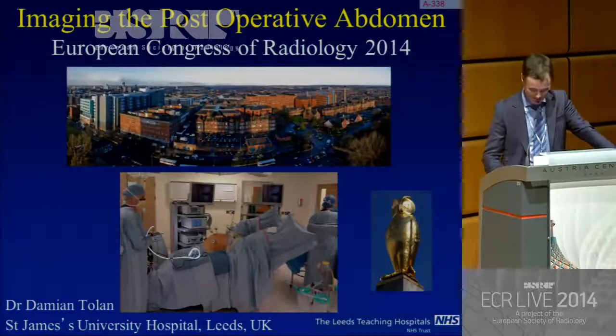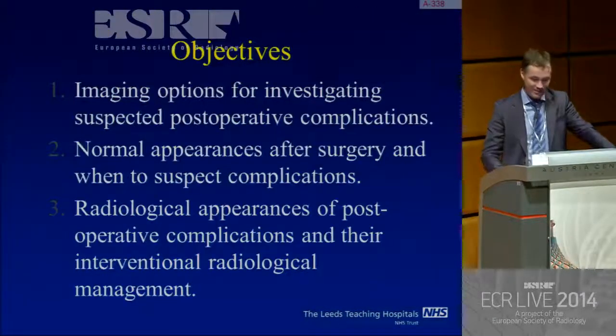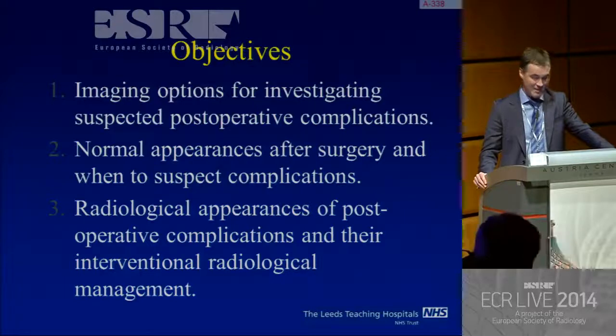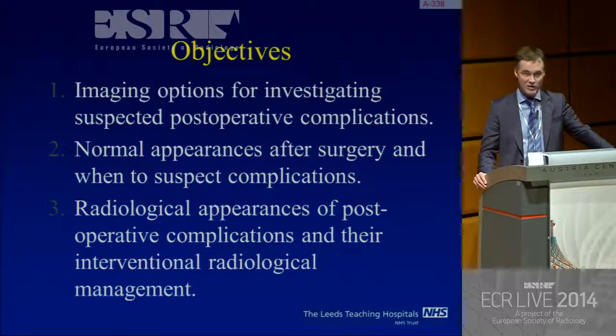So it's a great chance to speak to you all about something I think is really challenging to all of us. We're going to talk about the following areas as our objectives: the imaging options for investigating suspected postoperative complications, the normal appearances after surgery and when to suspect a complication, and then the radiological appearances of postoperative complications and their interventional management.